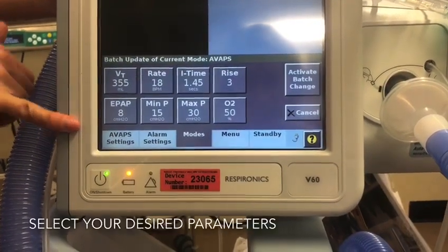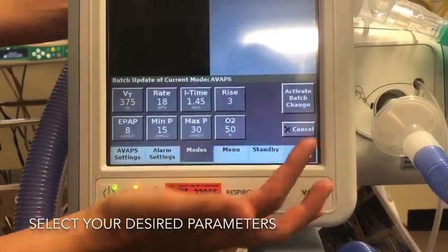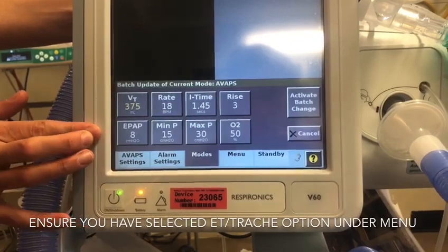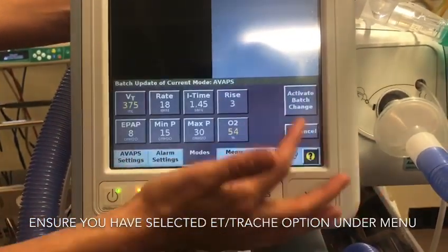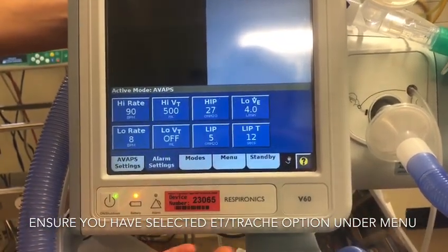You have your settings here. You can change your tidal volumes. This will be 6 mils per kilo. You can also change your CPAP or your EPAP, as the V60 calls it, or your oxygen easily. And accept your changes. You can change your alarm settings as you need.